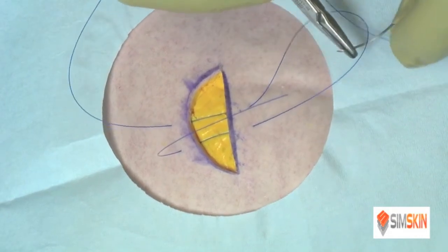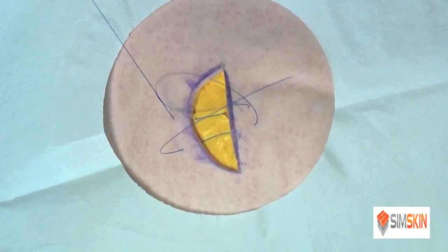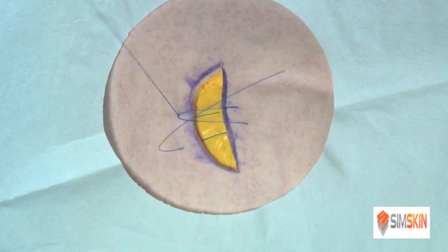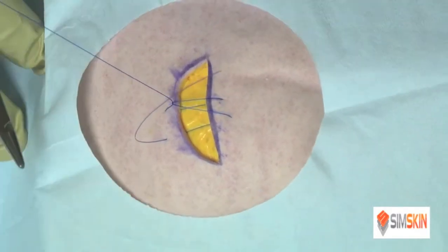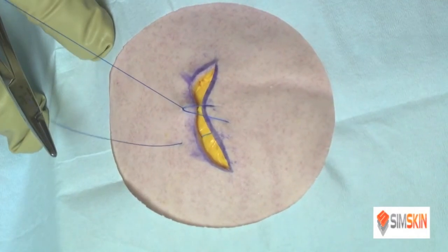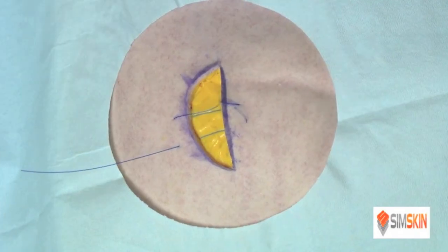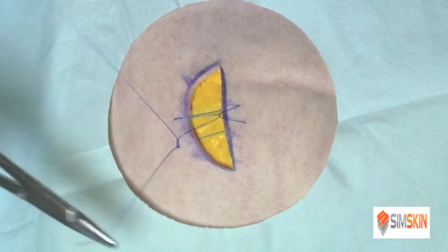Once you've set this up, you go back and you loop through the horizontal loop. Watch as we pull on that one end of the suture. You can bring this wound together, even though it's a high tension wound, because of the two-to-one mechanical advantage that's been set up.